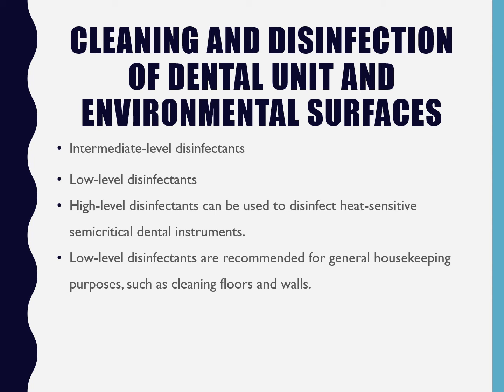It's very important that items that go into the cold sterile stay in the cold sterile for as long as it takes. Different chemicals require different amounts. Typically, it's anywhere between 12 to 24 hours. That's kind of like the norm. And so those items have to stay in the cold sterile for that amount of time before they're considered sterile. And if you take them out before that amount of time, let's just say it, they're not sterile.